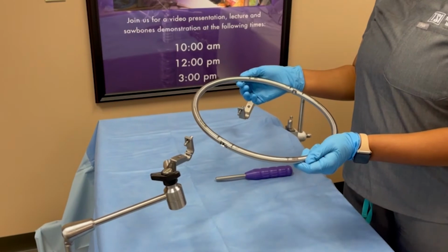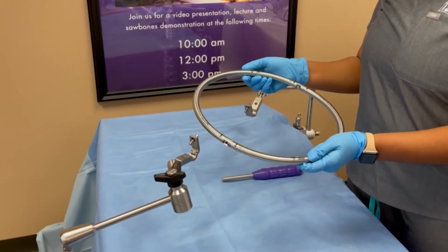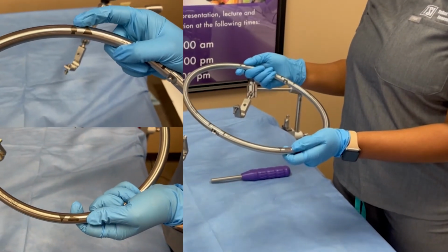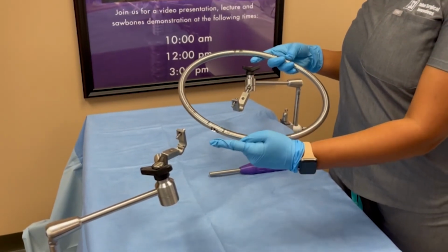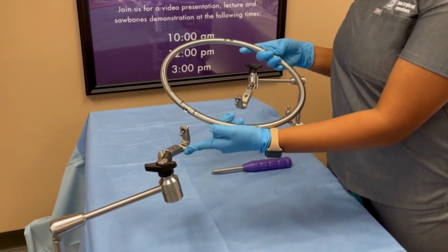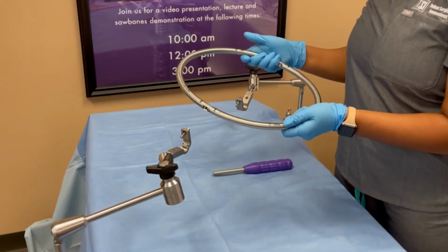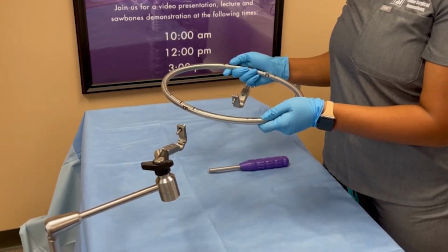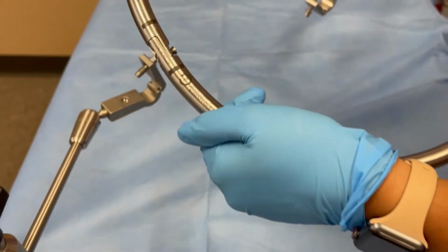Once you've assembled your retractor ring, you're going to identify 2 sets of markings. One of them is the identification for your caudal and cephalad direction. The second is markings that say attach rigid arm here, which is where you're going to position the ring on the clamp portion of the articulating arm to hold the ring. So once you've identified your caudal and cephalad markings, you're going to position them respectively with your patient, which will then align up your attach rigid arm here markings with the articulating arm.